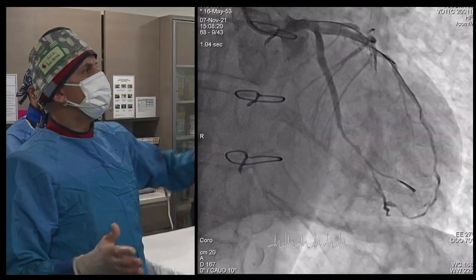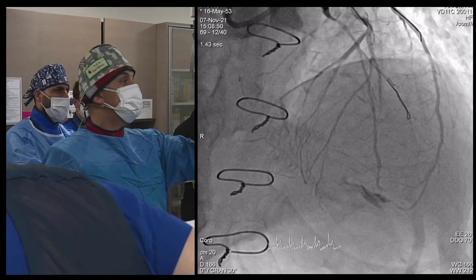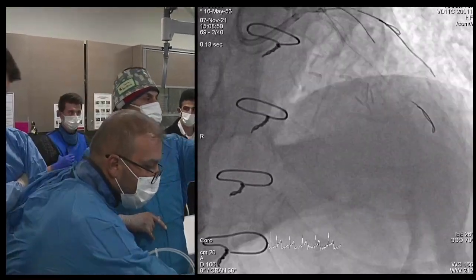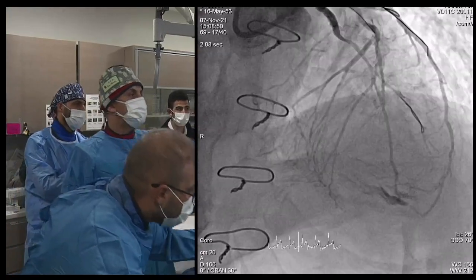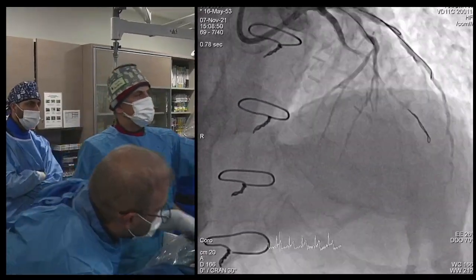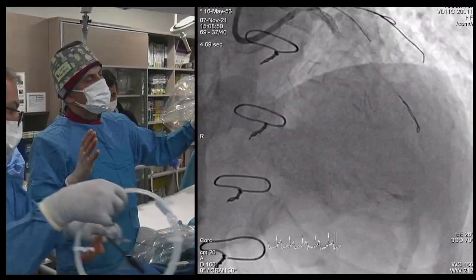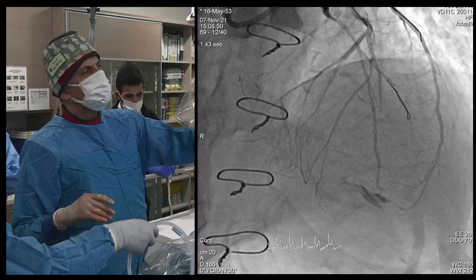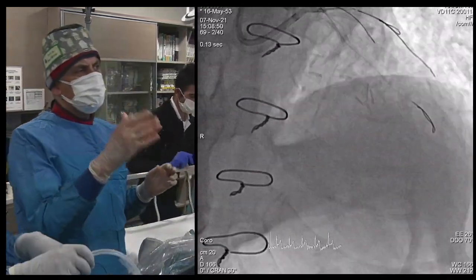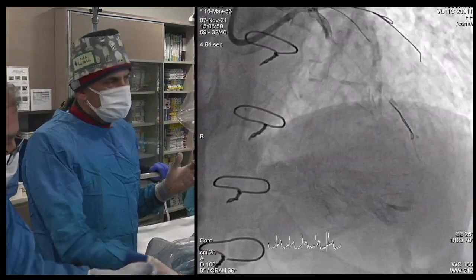We did kissing at 3.5 and 3.5. But looking at the distal vessel — great result overall — but we see an epicardial perforation here. Someone had warned me to watch the distal wire. It wasn't there before, but during the procedure I noticed my wire was knuckled and had gone somewhere. I was a little bit afraid of that.